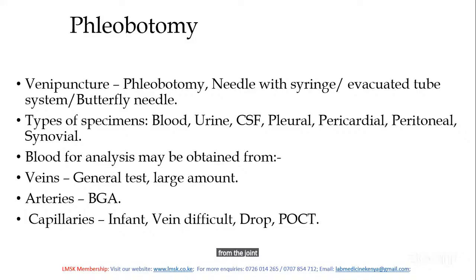But as I said, the major specimen of choice in clinical chemistry is blood. So our topic today will deal with blood specimen.